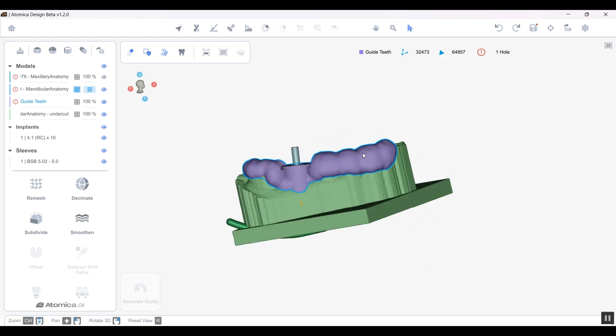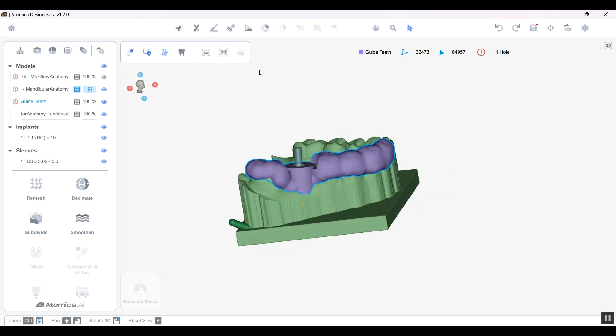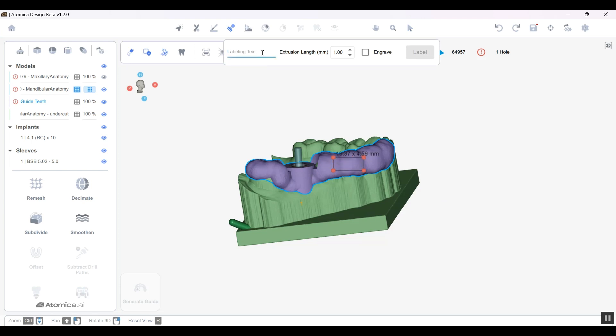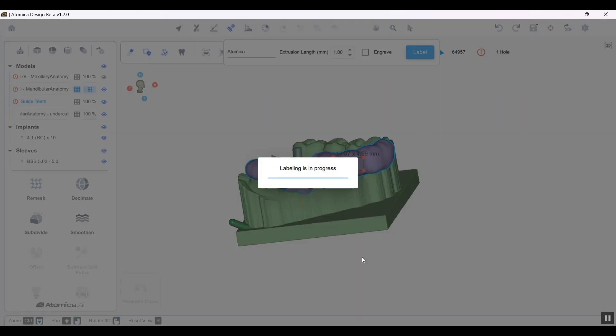You can add stamping to it. For example, it's Atomica. By ticking that, it will be engraved in the guide, and by unticking that, your label will be embossed out of the guide.